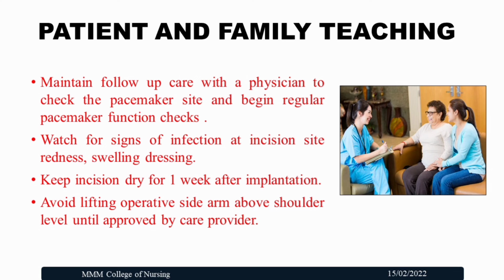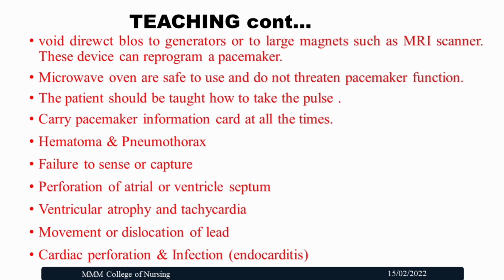Patient and family teaching includes maintaining follow-up care with the physician to check the pacemaker site and begin regular pacemaker function checks. Watch for signs of infection at the incision site, such as redness, swelling and drainage, and keep the incision dry for 1 week after implantation. Avoid lifting the operative side above shoulder level until approved by the care provider, and avoid direct blows. The large magnets of an MRI scan should be avoided, and microwave ovens are safe to use and do not interfere with pacemaker function.